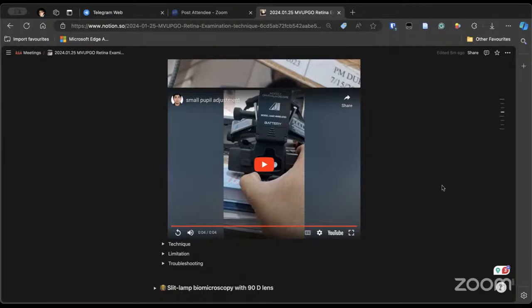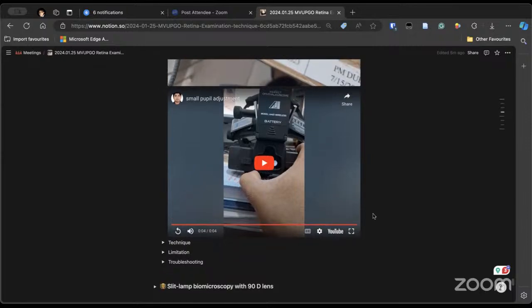Do you know of any mechanism in which both the pupils of the examiner can be brought a little closer? Like this mechanism is also bringing the pupils. Essentially, the mechanism is bringing your pupils together so that you can peep through a small pupil. Some advanced slit lamps will have a similar mechanism. Can anyone tell us the name of the mechanism?